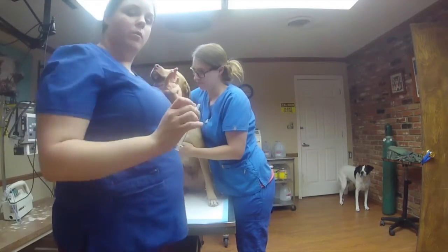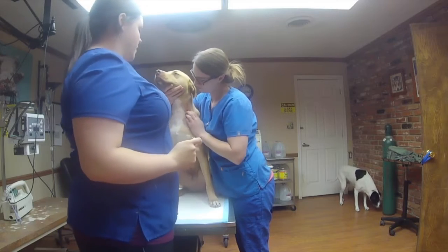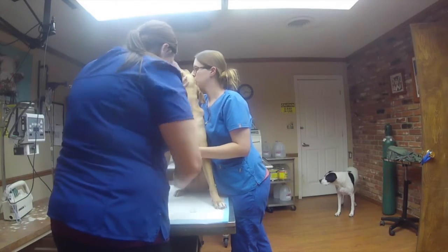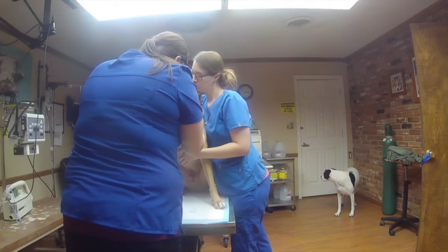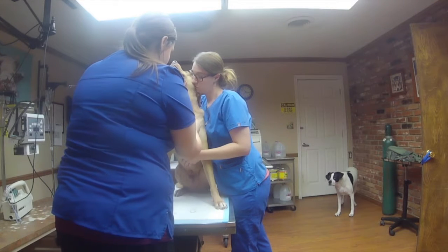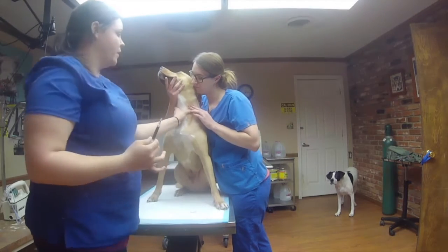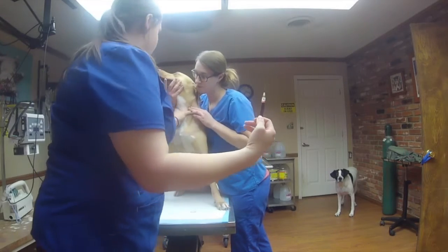I am here with my preceptor, Jessica, and I'm going to draw from the jugular vein of a canine. I'm going to make sure that the needle is beveled up. Then you want to apply a little bit of pressure to make sure that he does not continue bleeding afterwards. And that's how you draw from the jugular vein.